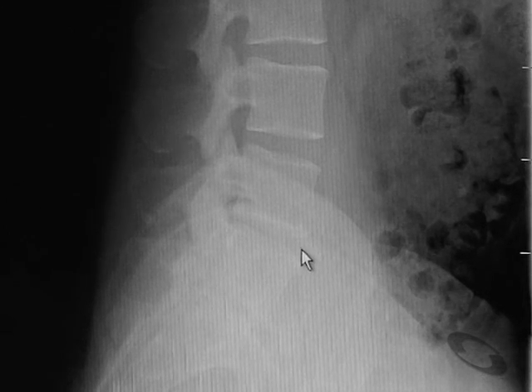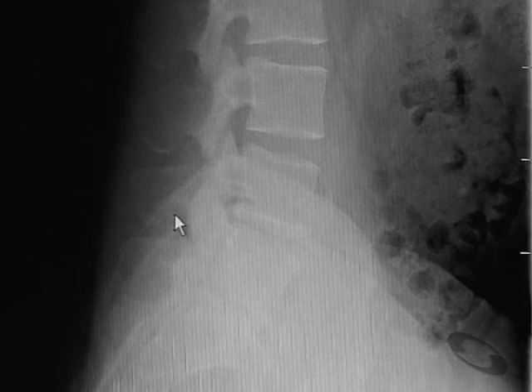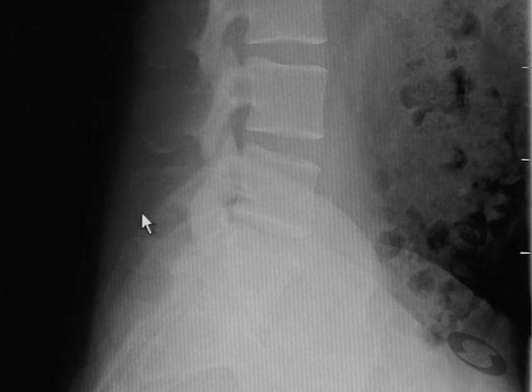Our intended operation today is going to be to take this disc out from an anterior lumbar interbody fusion. We'll use the Staliff intervertebral cage and screws to reestablish the height and establish lumbar lordosis. This is the spinous process of L5. This is the spinous process of S1. We will do a posterior interlaminar decompression. We will smooth off the inferior aspect of this spinous process and then insert the coflex-F implant.